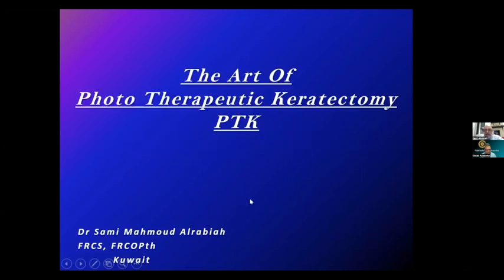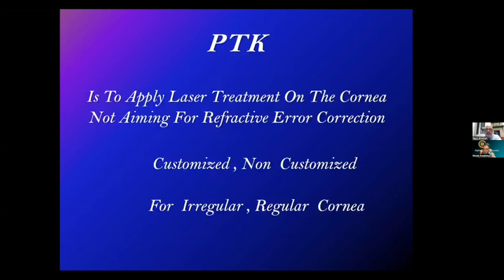Today we're talking about the art of phototherapeutic keratectomy. I think it is an art, phototherapeutic keratectomy. It's not just a science. Phototherapeutic keratectomy is to apply laser on the cornea, but not aiming for refractive error correction. We are trying to correct something else.